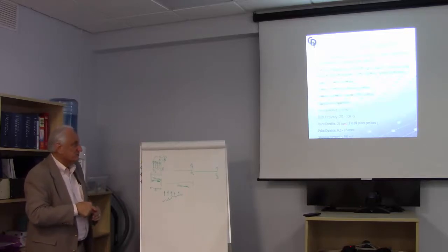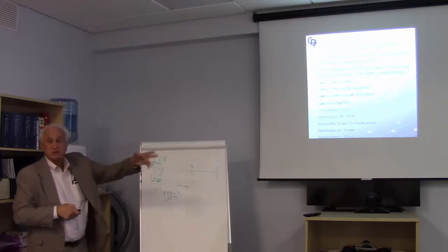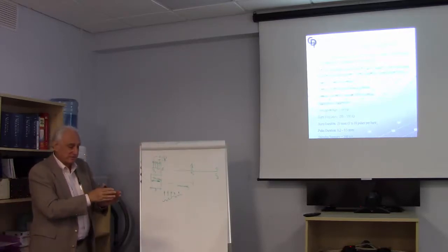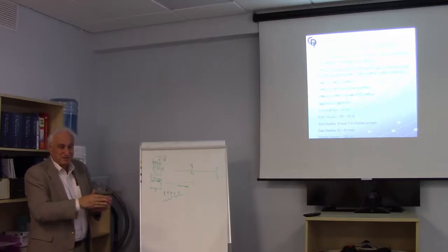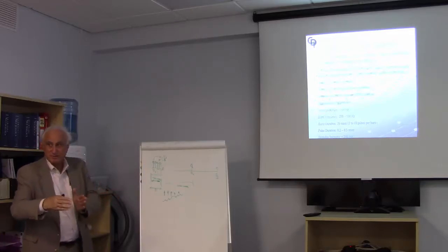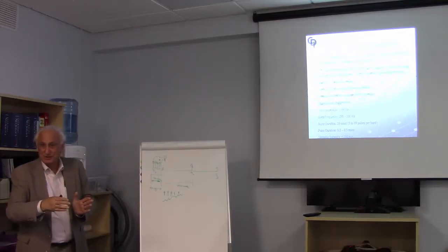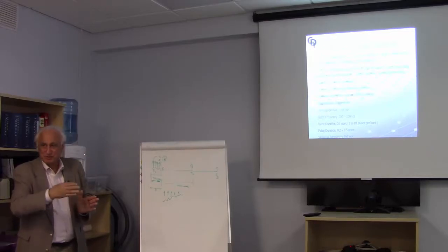The burst duration, we like 20 milliseconds, and when we're looking at the data, you can see you've got a burst at the beginning, and then you're separated from the motor potential, so you can clearly see the difference between the two. You're not trying to look at a motor potential while bursts of stimuli are occurring right at the same time.